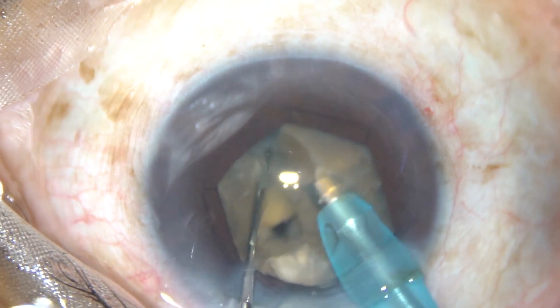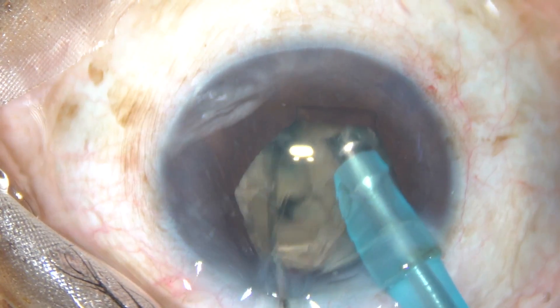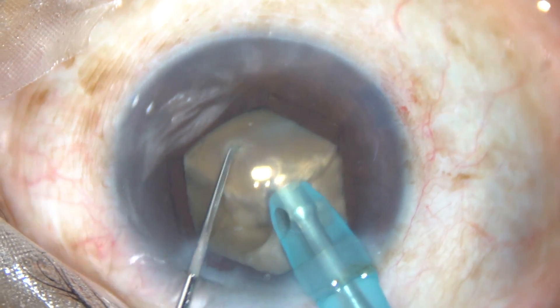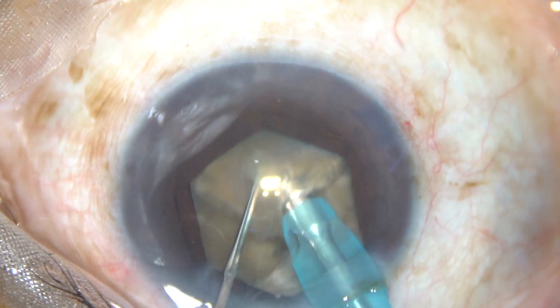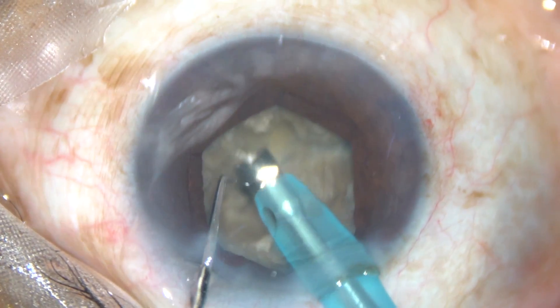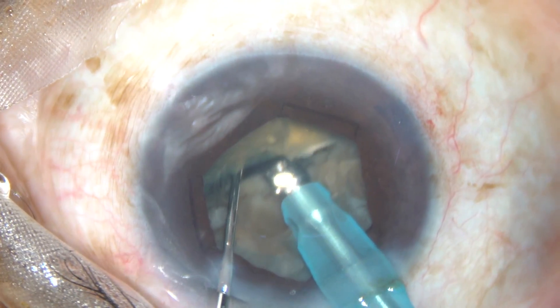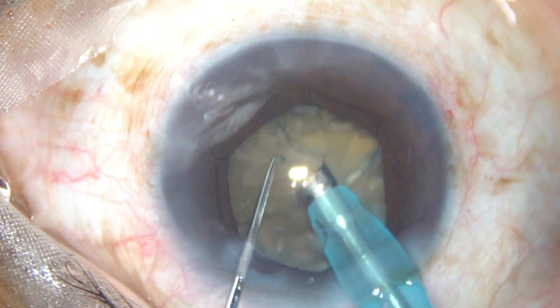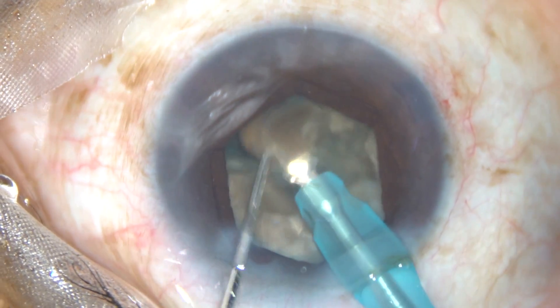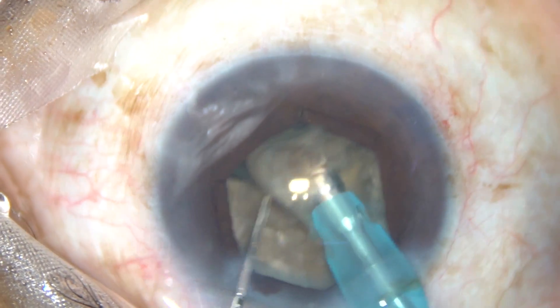However, this hemi-nucleus is not getting divided into pieces. There is a leathery band of fiber joining these pieces. So what I am doing is lifting the inner edge and applying power where the leathery band was, and the pieces get separated.